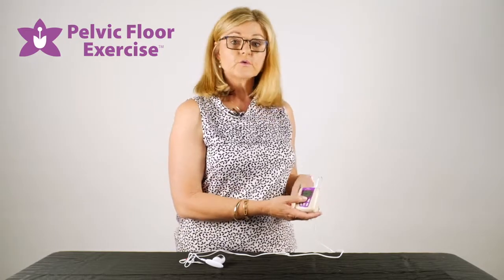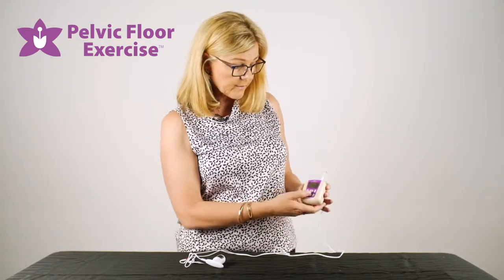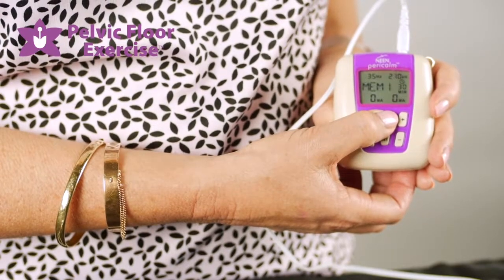Your physio should have told you which program they'd like you to use. We use the program button to scroll through the different programs, so your health professional should guide you with this.